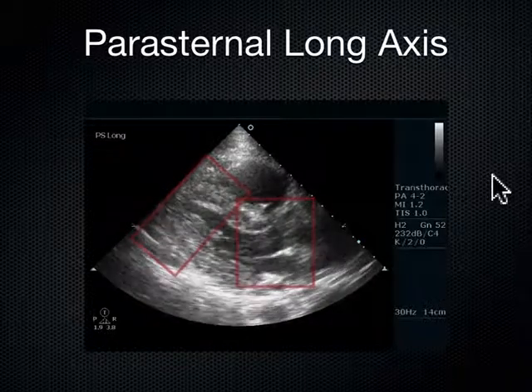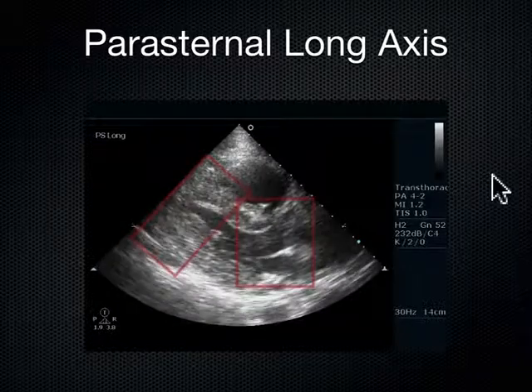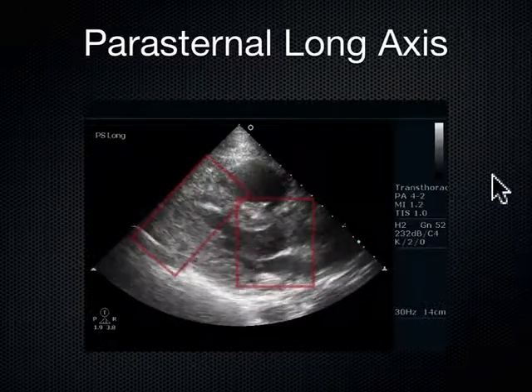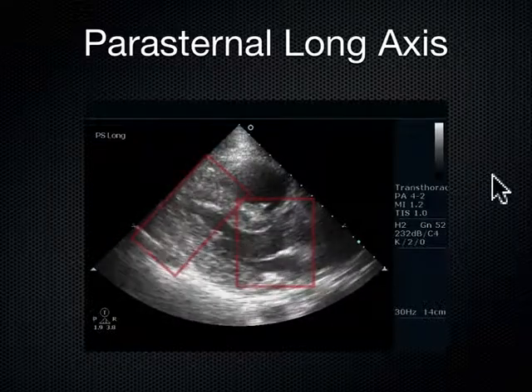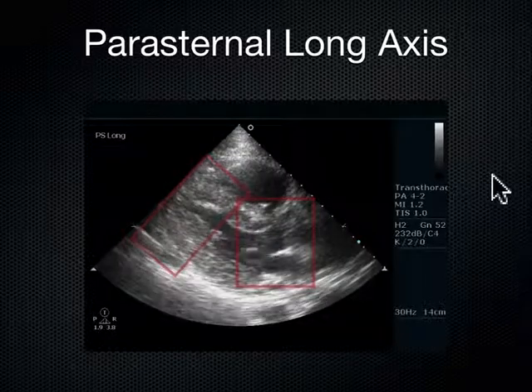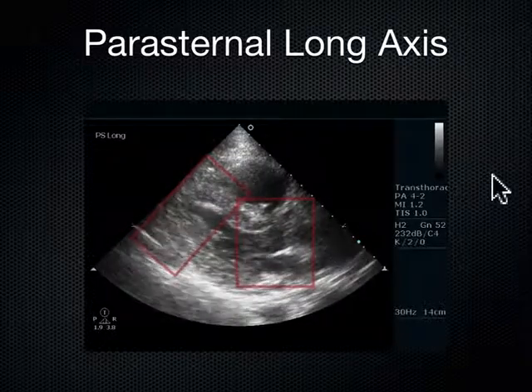Well, if I can see the mitral valve on the screen, I'm pretty much at the midpoint of this person's heart. So I see the mitral valve on the screen. It's a good question. I'm not off to one side or the other. I'm straight dead down the exact, sagittal axis, not to use the word sagittal, long axis, sorry, of this heart.